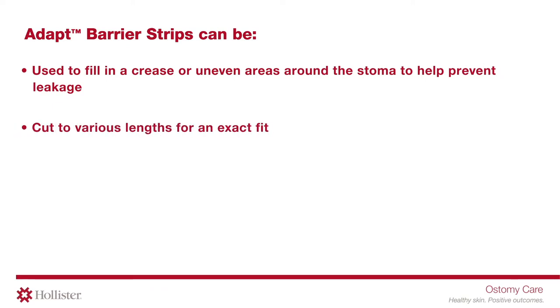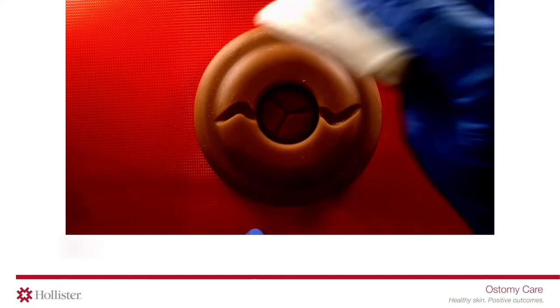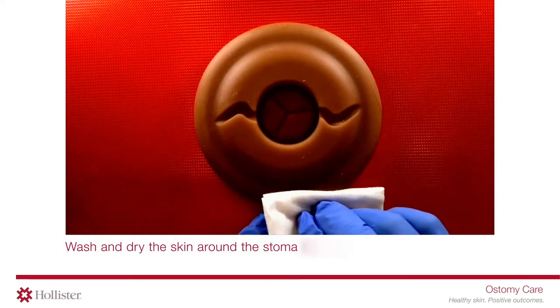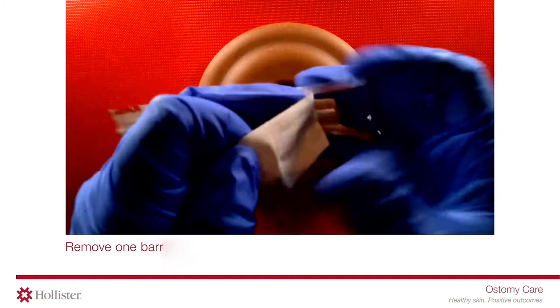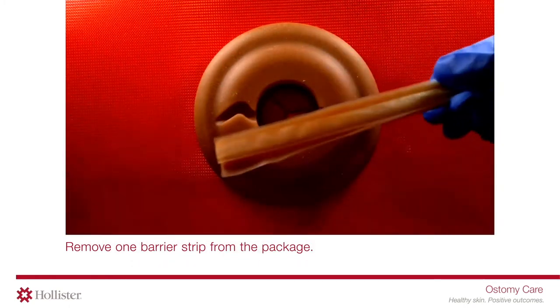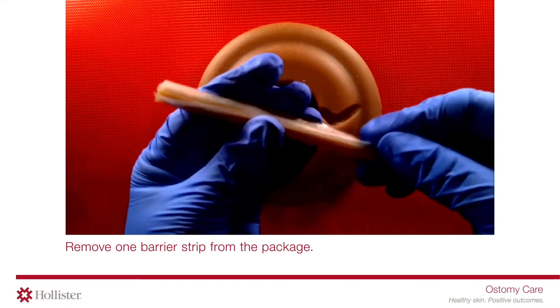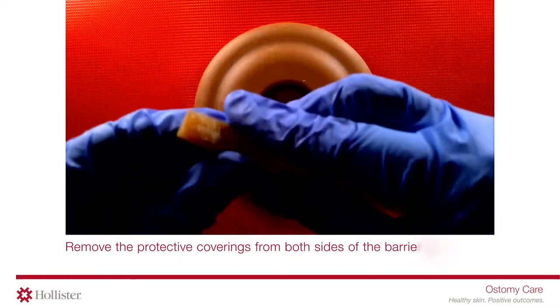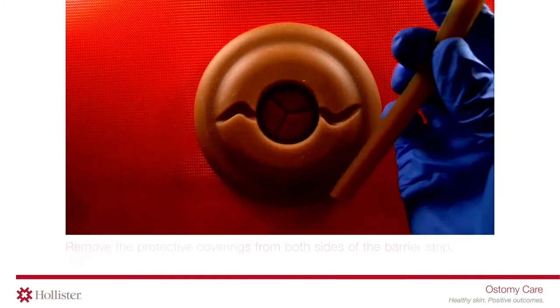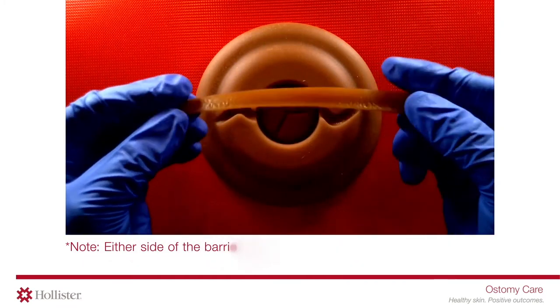Wash and dry the skin around the stoma thoroughly. Remove one barrier strip from the package and remove the protective coverings from both sides of the barrier strip.